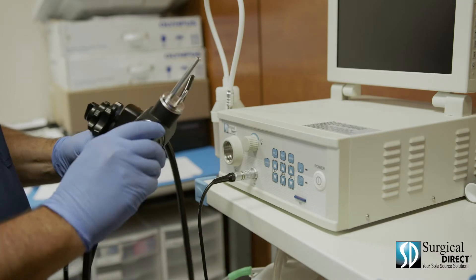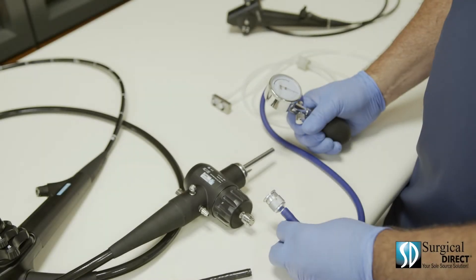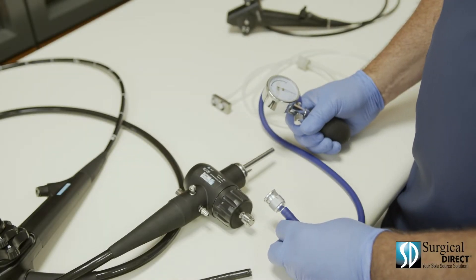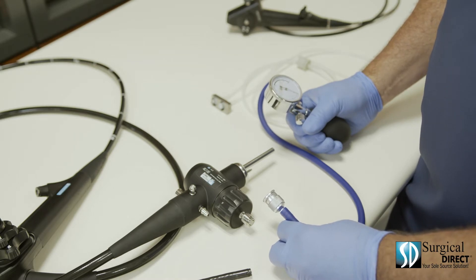Always place the soaking cap on the scope when it's not in use. The most important part of caring for your endoscope is leak testing. Catching a leak early is the difference between a complete rebuild on a scope and a small bending rubber repair.